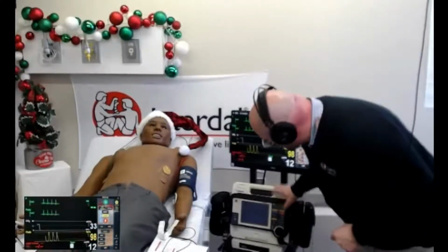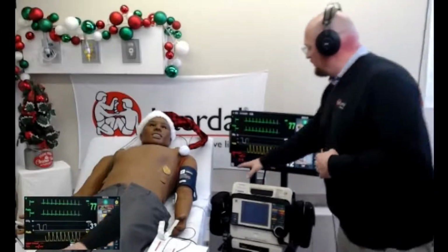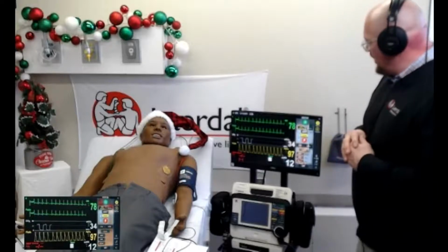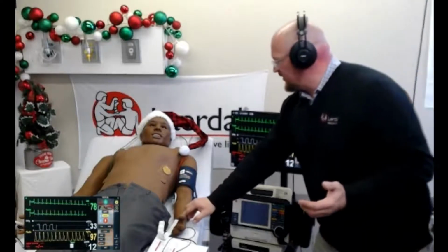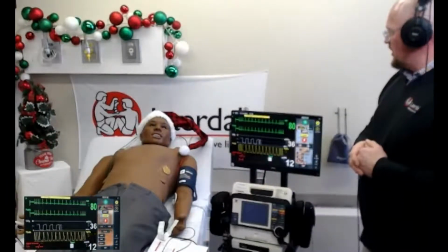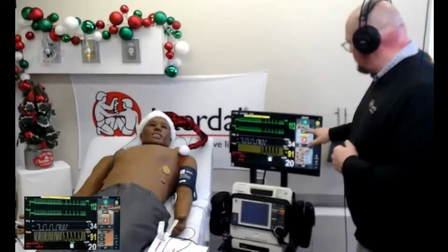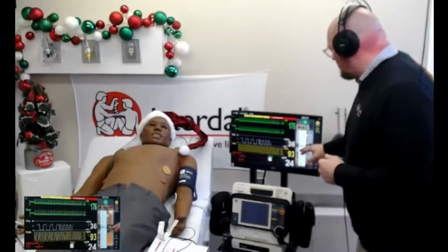I can do the blood pressure down here on the defibrillator, or sorry, we're not using the defibrillator. We're going with the clinical virtual monitor up here. So we can turn all that on, and now let's make him go into that SVT again. There we go, he's gone into that SVT, so I can recognize that. You do, and this is not going to hurt you like the other one did, right? And it didn't hurt him.